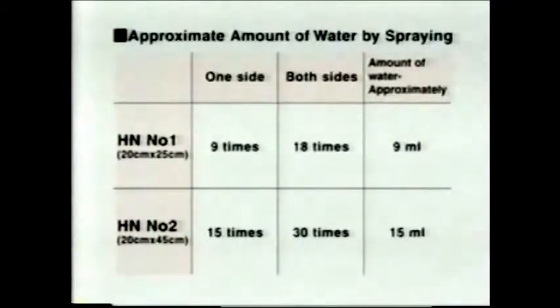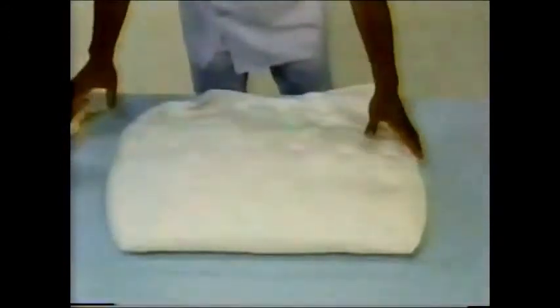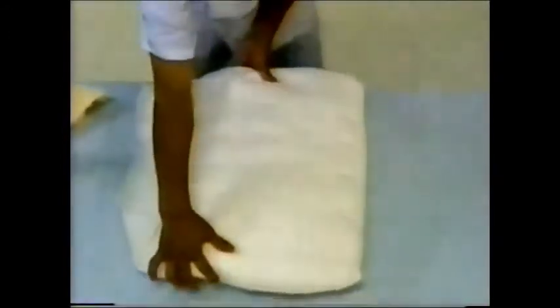Approximate amount of water by spraying. Spray evenly on both sides.